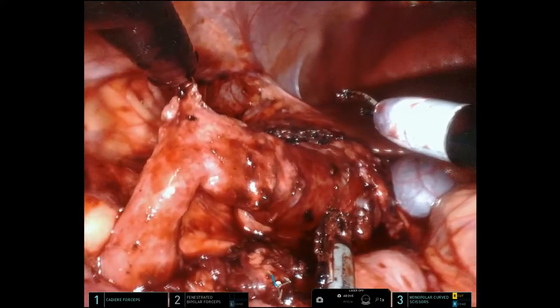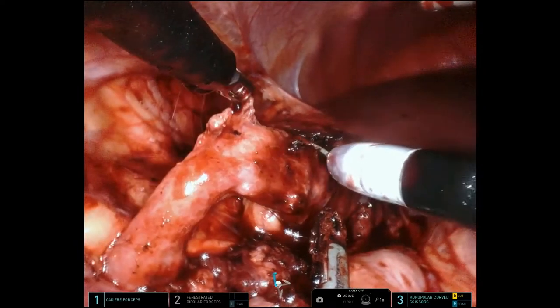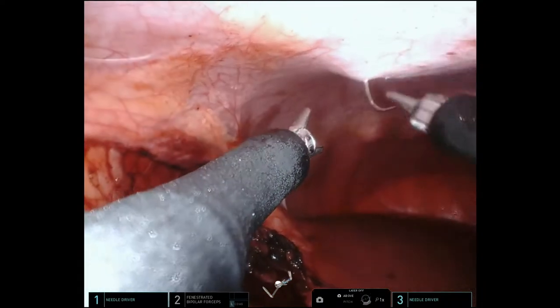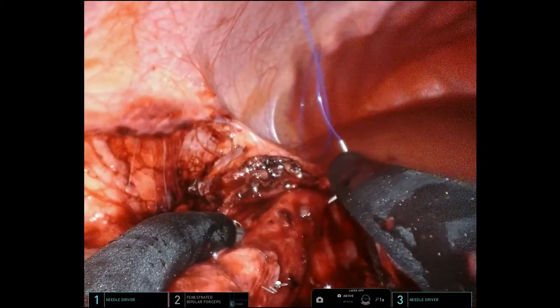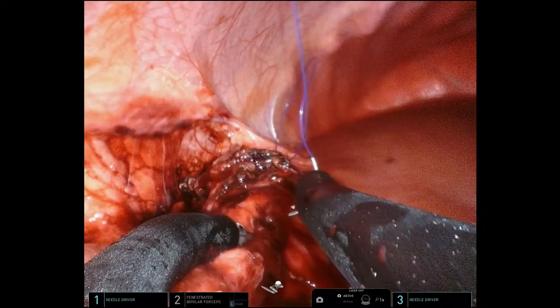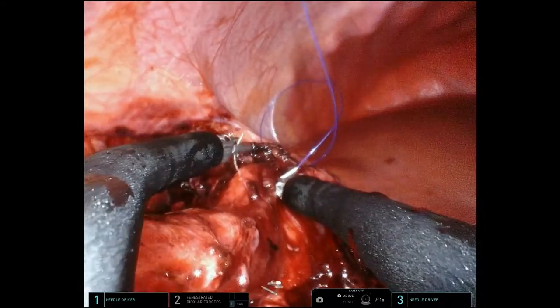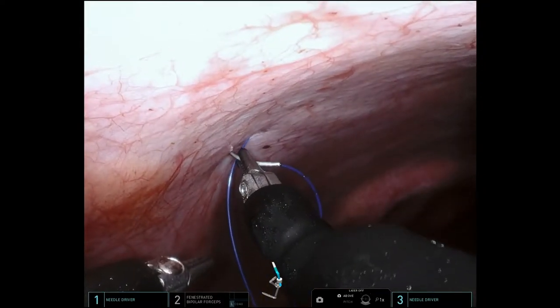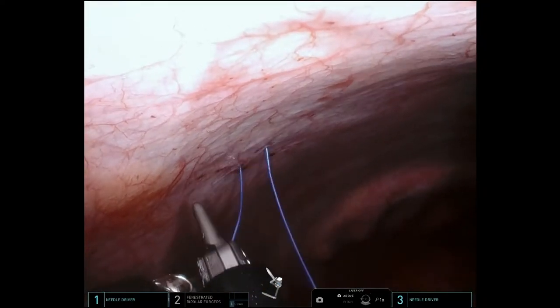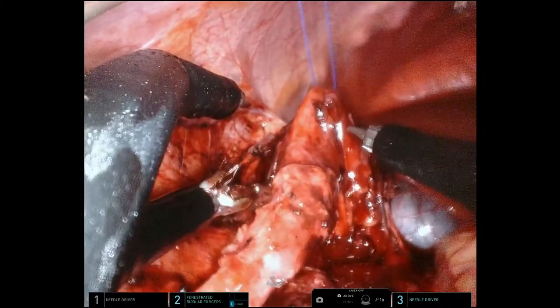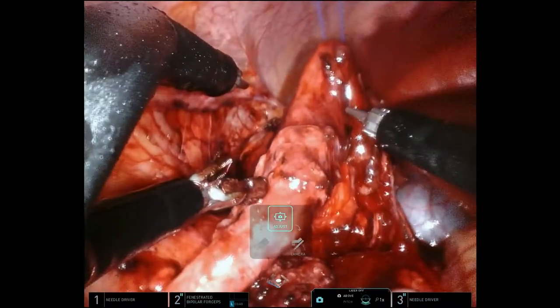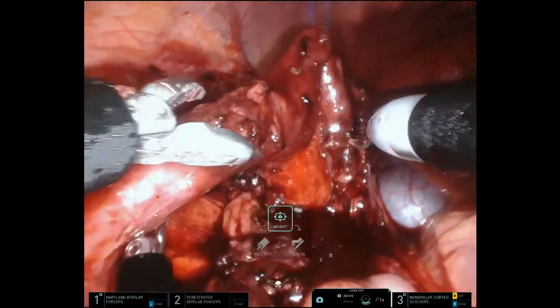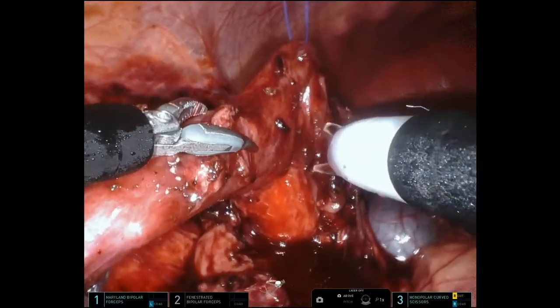You can see the area of the UPJ right there that's strictured and narrowed. As I typically do with a robot-assisted laparoscopic pyeloplasty, I bring in a hitch stitch just to stabilize the renal pelvis and make the dissection, the dismemberment, and the anastomosis a little bit easier. This is hiking up the renal pelvis and you can see how irregular the renal pelvis and proximal ureter look.